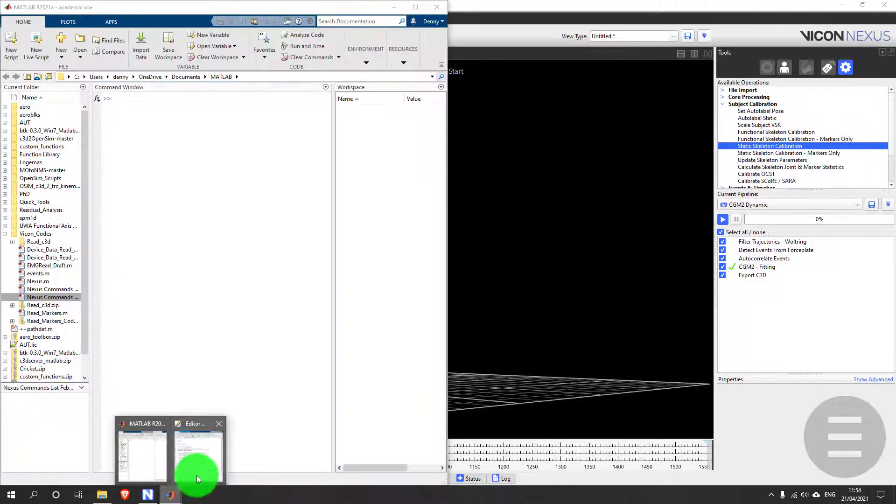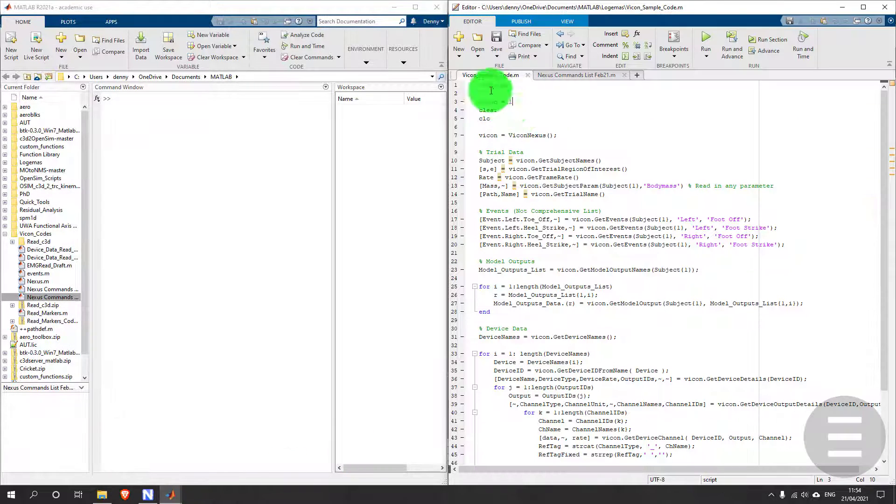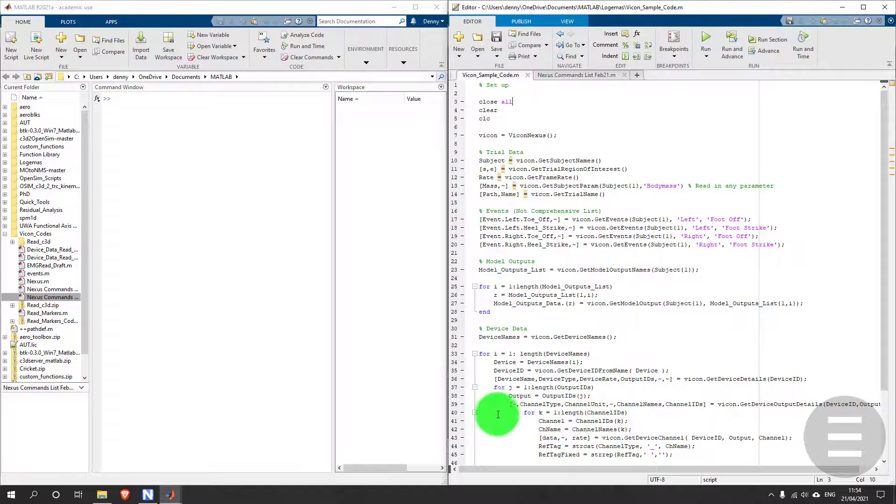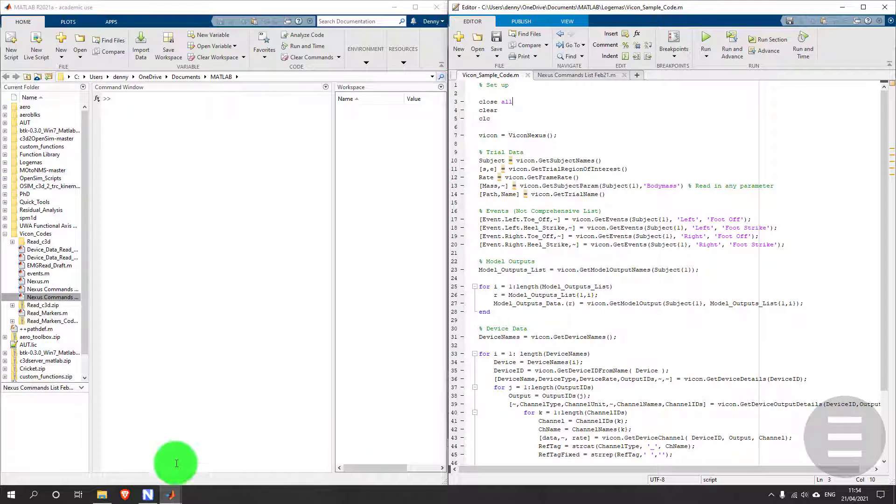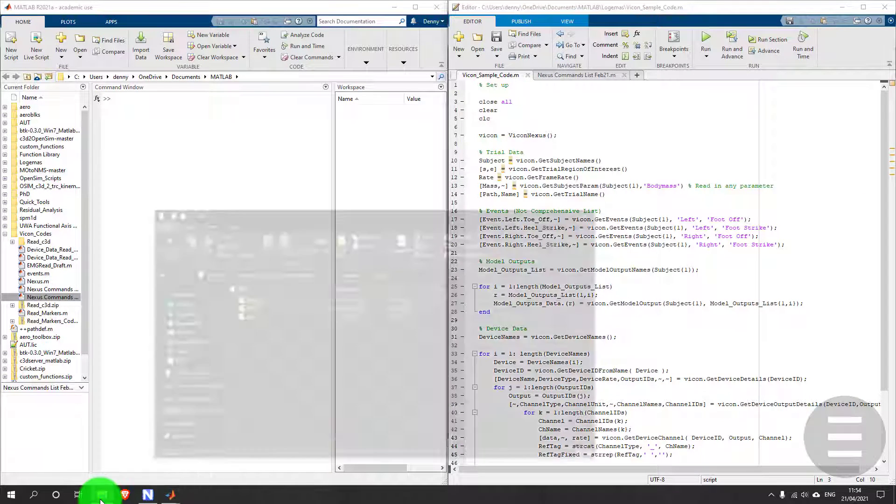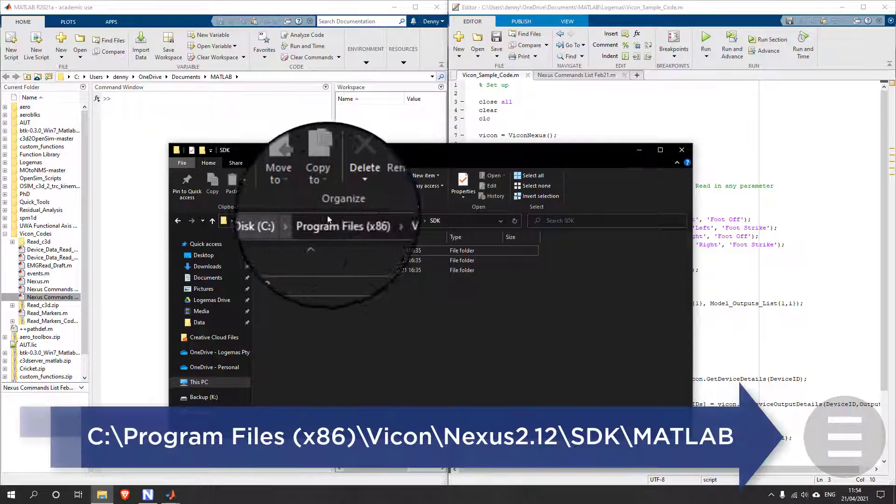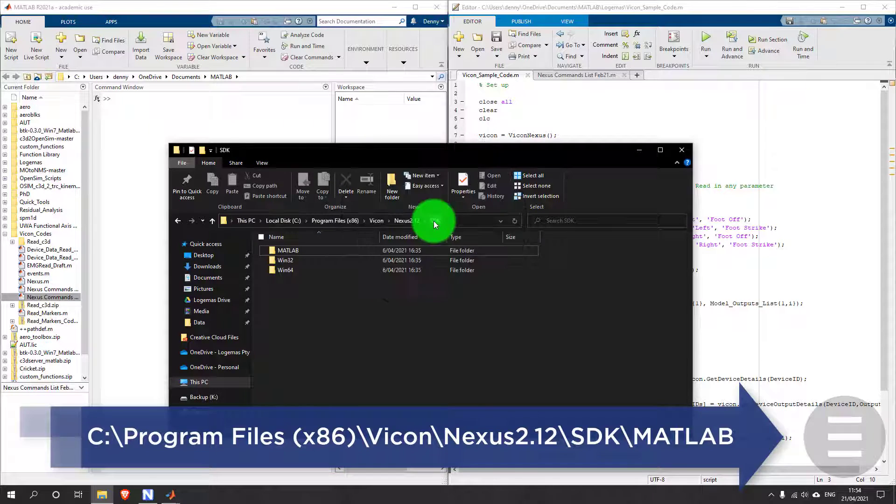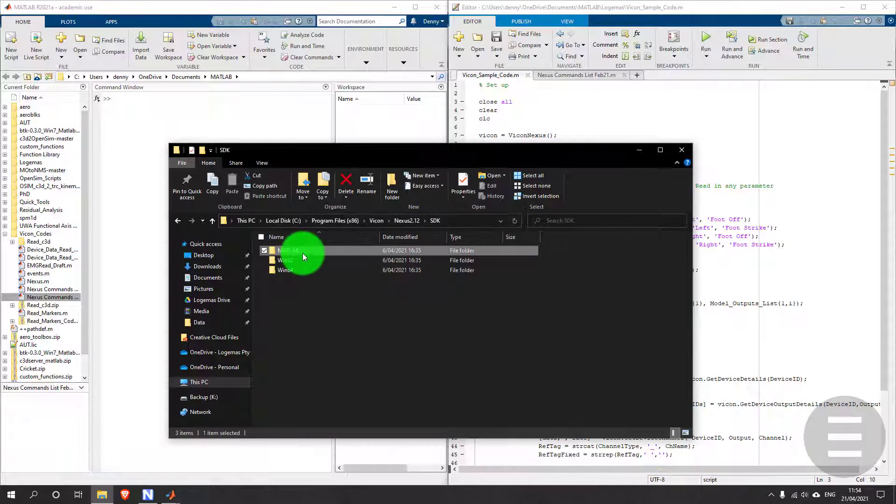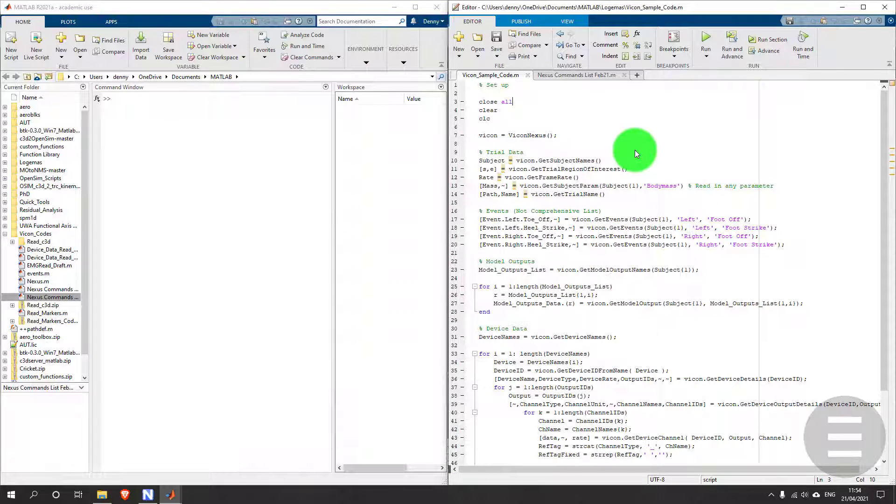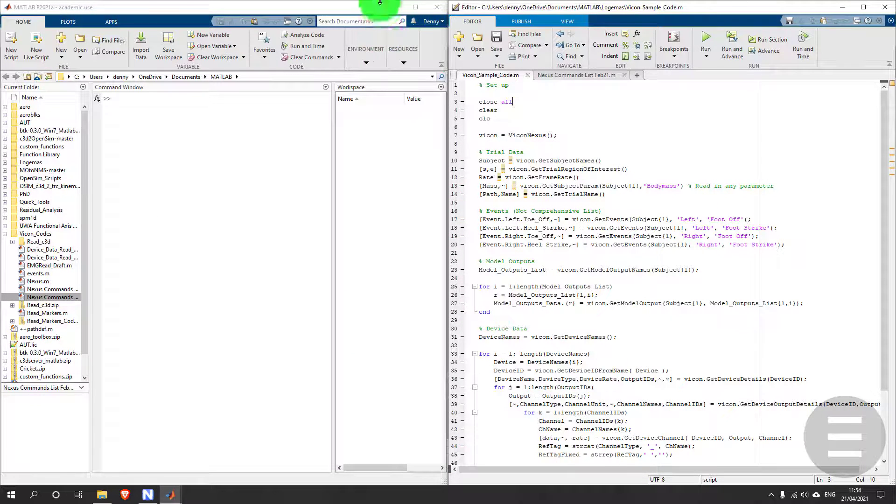In the background I have MATLAB open and a sample script ready to go. Before I can run this, I need to add this file path to the MATLAB environment so that it can find the Vicon scripts. Once added, that's ready to go.